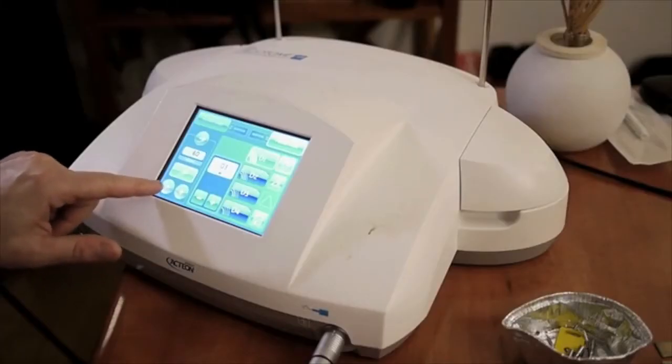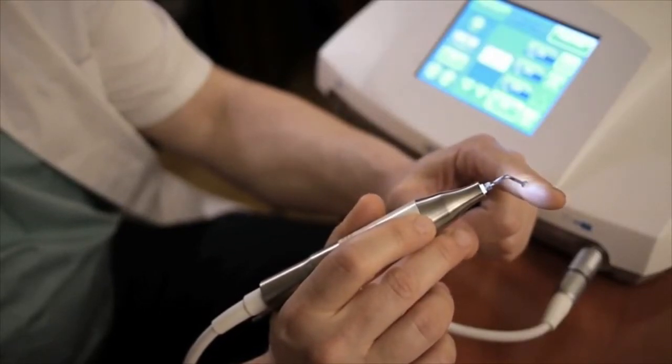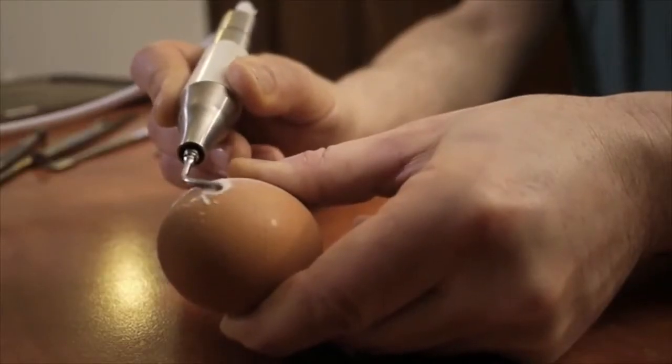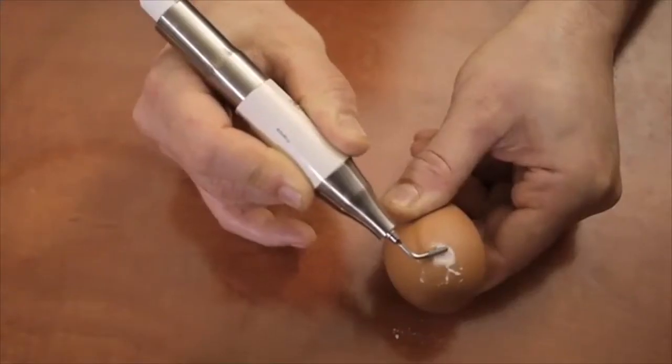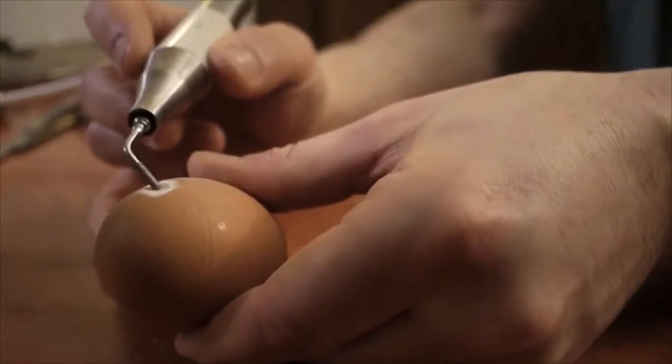First, what is piezosurgery? Well, piezo instruments use the piezo transducer properties to convert electrical energy into extremely rapid mechanical vibrations. Those ultrasonic vibrations selectively create a cavitation effect on the hard tissues, dissolving the bones and the hard cartilages. It's therefore possible to cut, to rasp, or to trim hard tissue while leaving the soft tissue untouched.